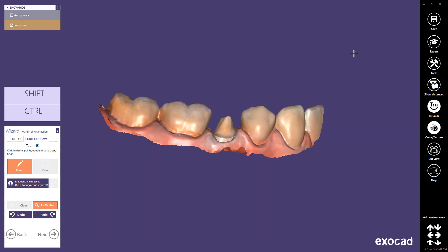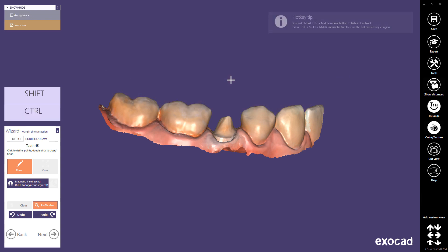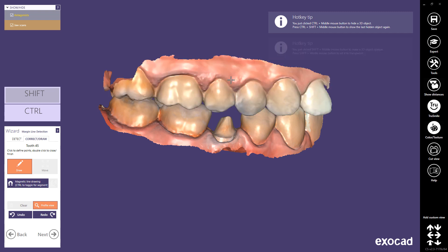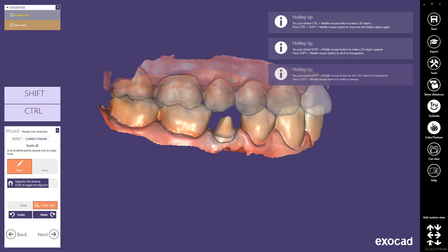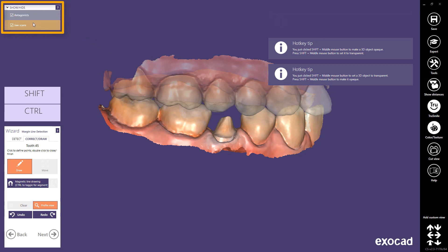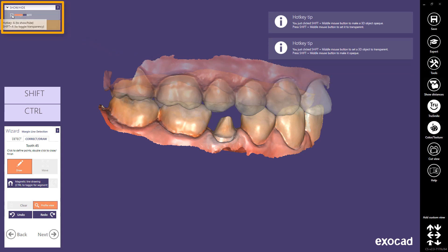The most common hotkeys include: type A to hide and show the antagonist; type S to show and hide the jaw scan. Control and middle mouse button hides the object under the pointer. Control, Shift and middle mouse button displays it again. Shift and the middle mouse button toggles the transparency of the object under the pointer. Or you can show or hide scene objects in Group Selector.